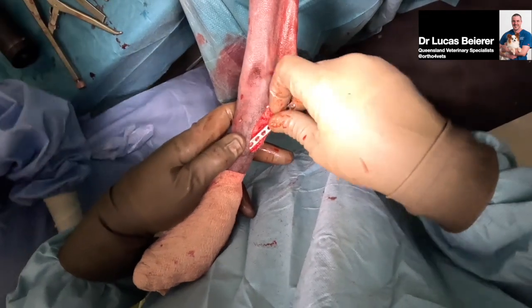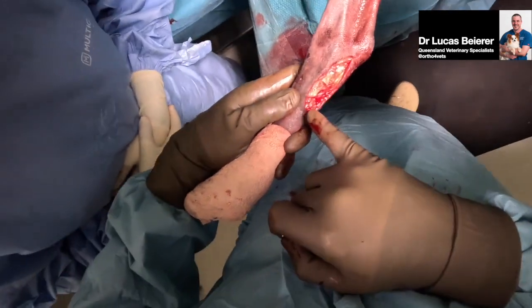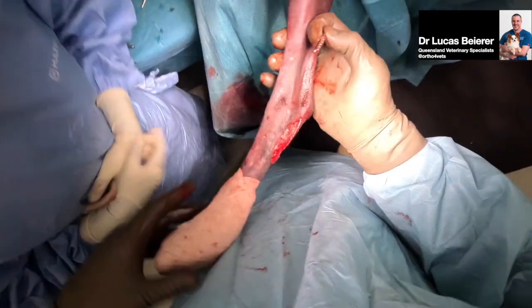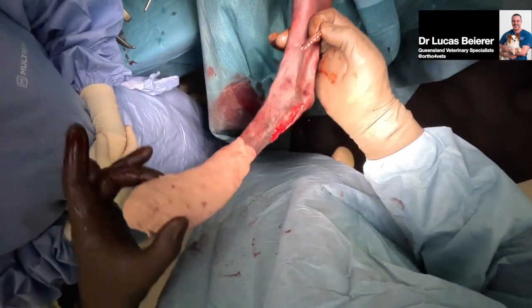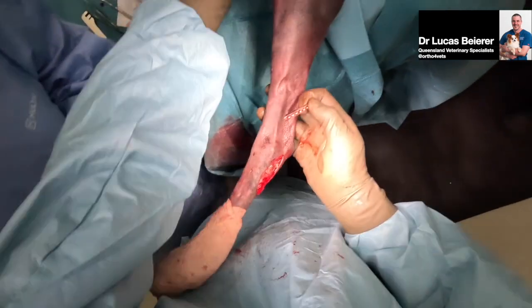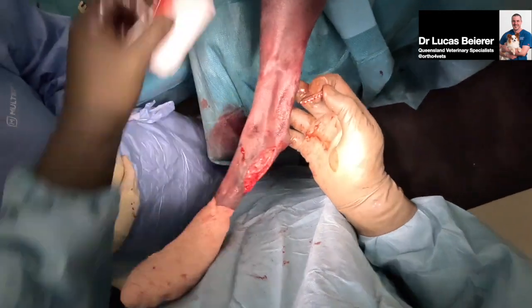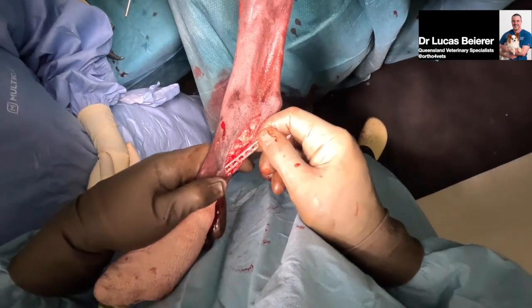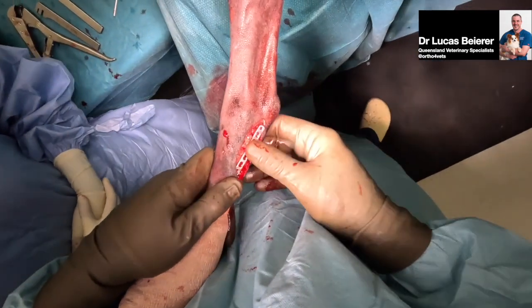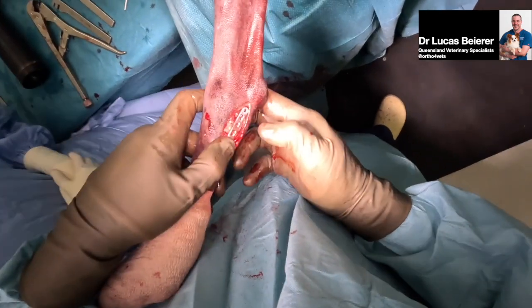So we can see the joint space at the tarsometatarsal. You can see that opening. Oh, yeah. And I think what's interesting is it's almost inherently stable with that central tarsal bone. It doesn't want to collapse. There's still play. So if you wanted to just cast it at this point, that would be an option, but it's not an entirely enjoyable process in a greyhound.